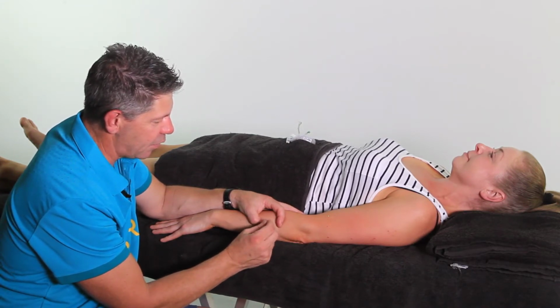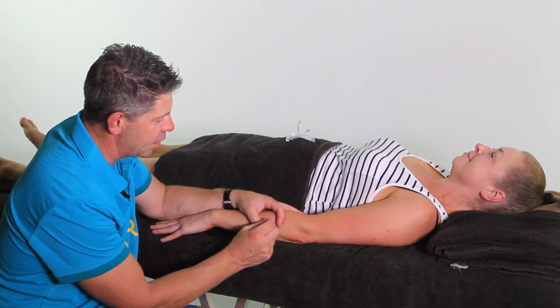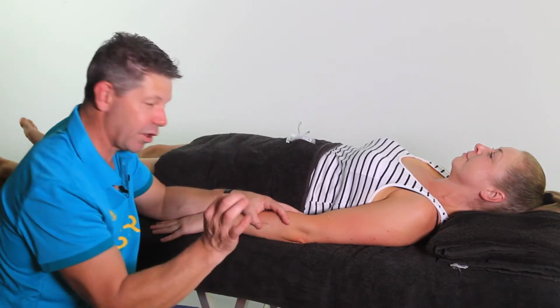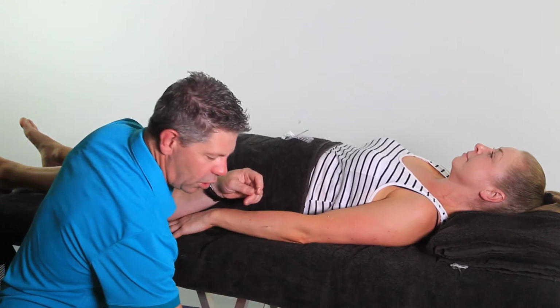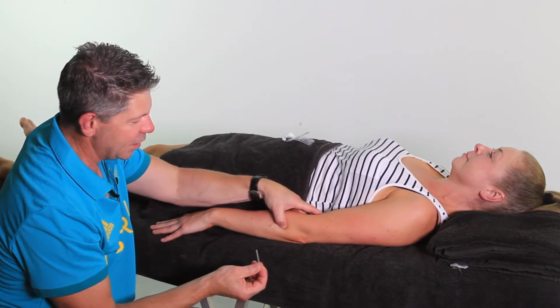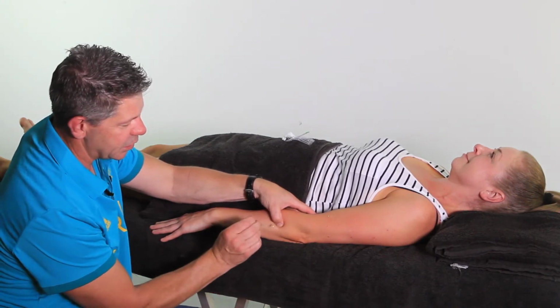And then it's just a matter of piercing through, picking up that trigger point, feel that there, and then we leave it, okay? We don't need to agitate it. If you hit the right spot, let the needle do the rest. All right, so now I'm going to move a little bit further along and pick up any other associated sensitivities in that area as well. So you'll notice as I'm palpating that, you'll see the needle moving. That's all okay, trust me.